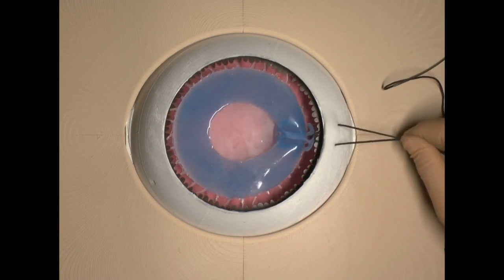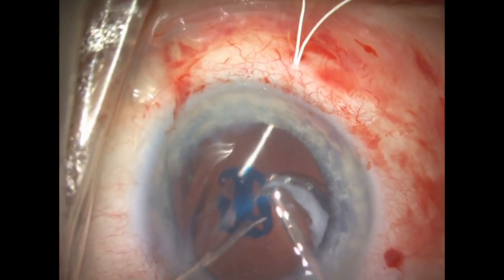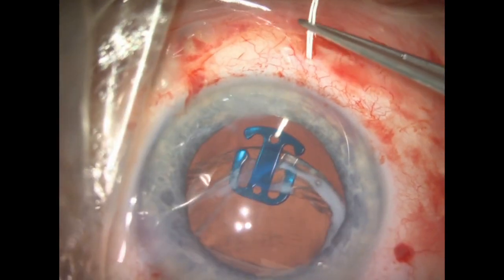We appreciate stabilization of a capsular edge by AC anchor, mainly in fibrotic capsules, where implanting a ring is very difficult.